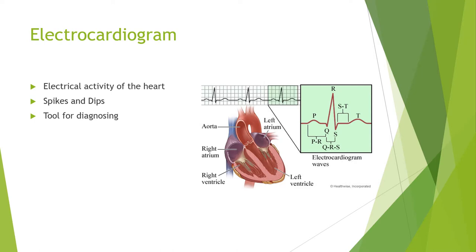The electrocardiogram, otherwise known as an EKG or ECG, is a test that checks for problems with the electrical activity of your heart. An EKG shows the heart's electrical activity as lines tracing on a paper, with spikes and dips on the tracing that are called waves. A recording of the electrical potential generated by the electrical activity of the heart is made on the surface of the thorax, or on the outside of your chest. It is a tool for diagnosing.